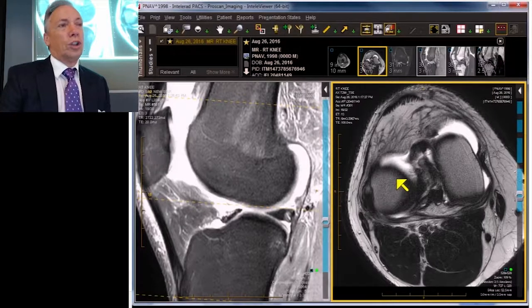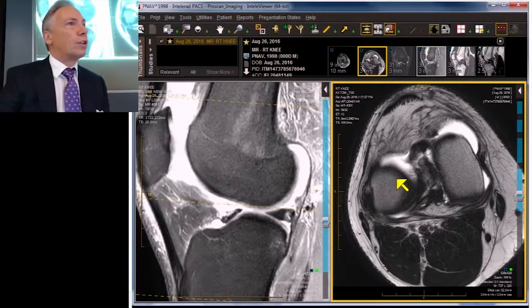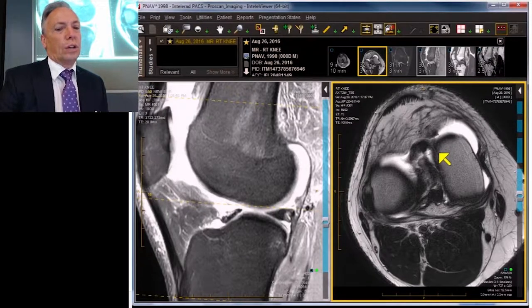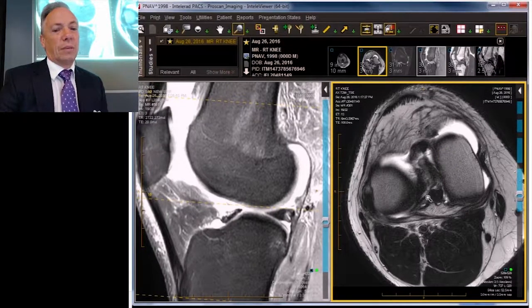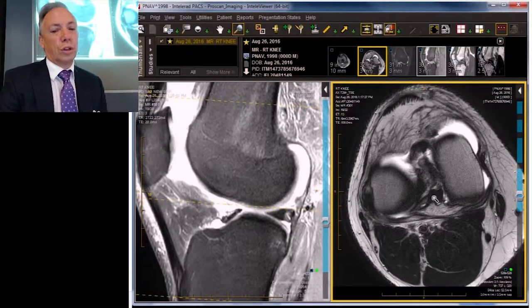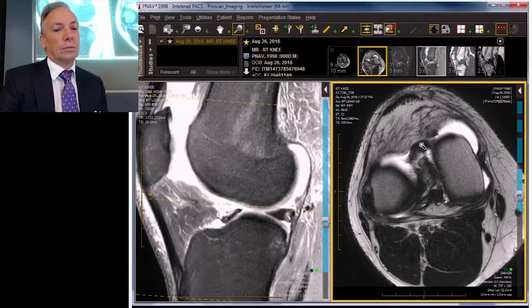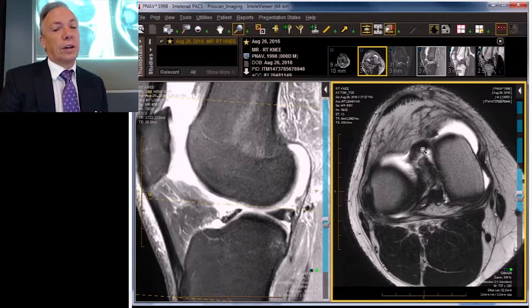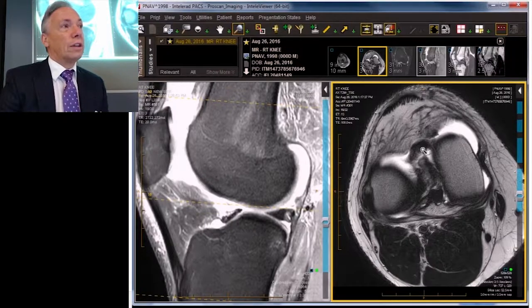This is a youngish man, not a juvenile. Let's take a quick look at the axial. Those of you that do quite a bit of MRI may notice there's an extra structure in here — not that one, that's the cruciate ligament — this one. What is that? It happens to be the anterior cruciate ligament that is fat and bloody and laying down anteriorly. That's not why we're here.